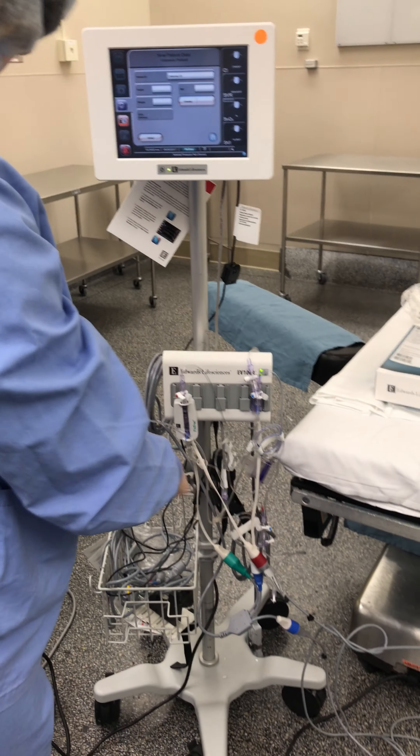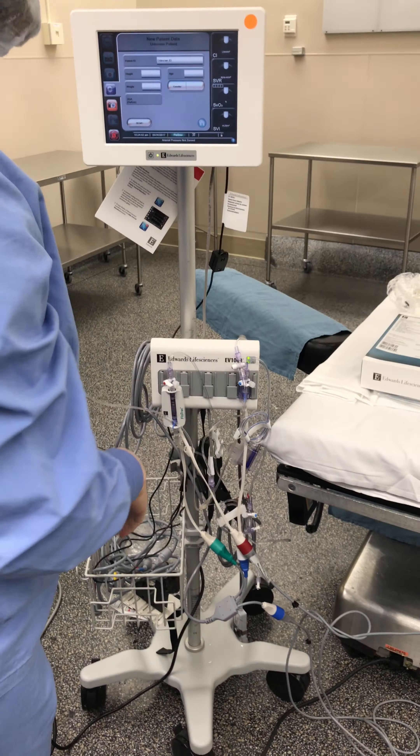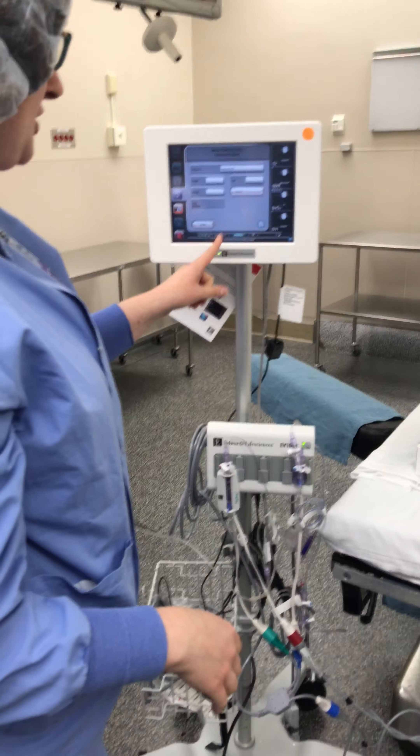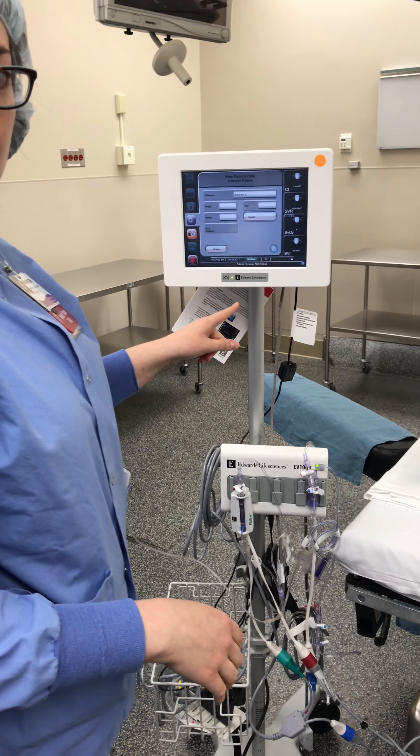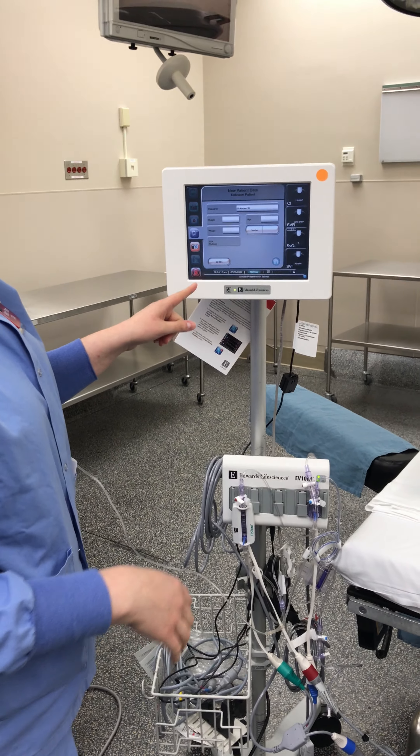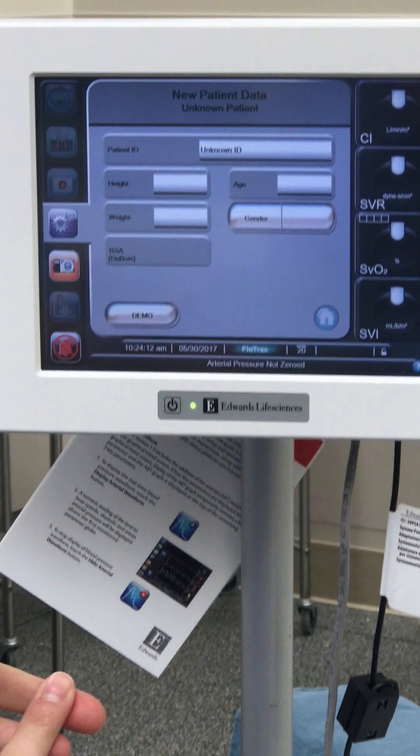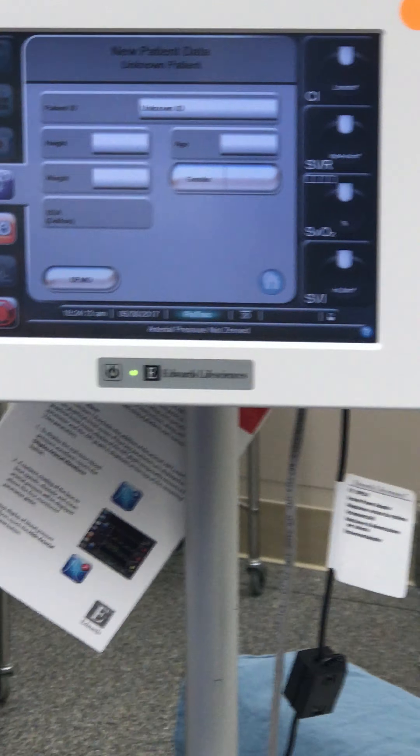Now we have our cables hooked up. We're going to go ahead and put patient information into the computer. You need the patient's height, weight, age, and gender.